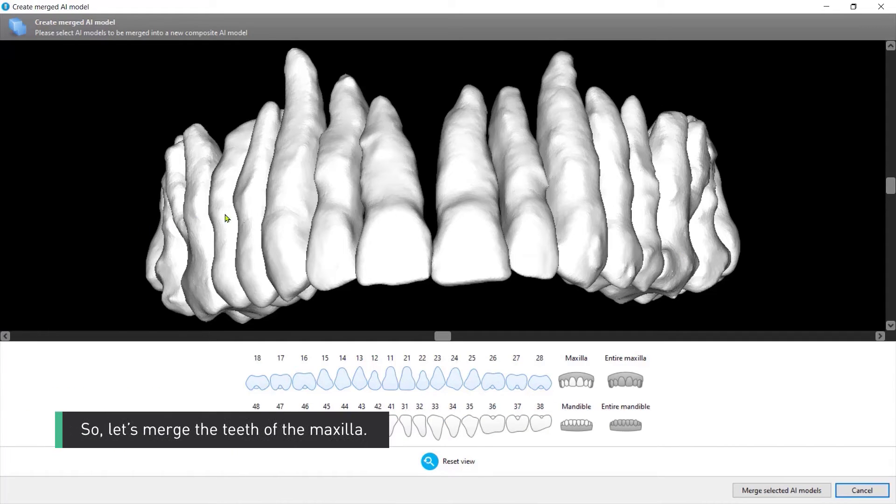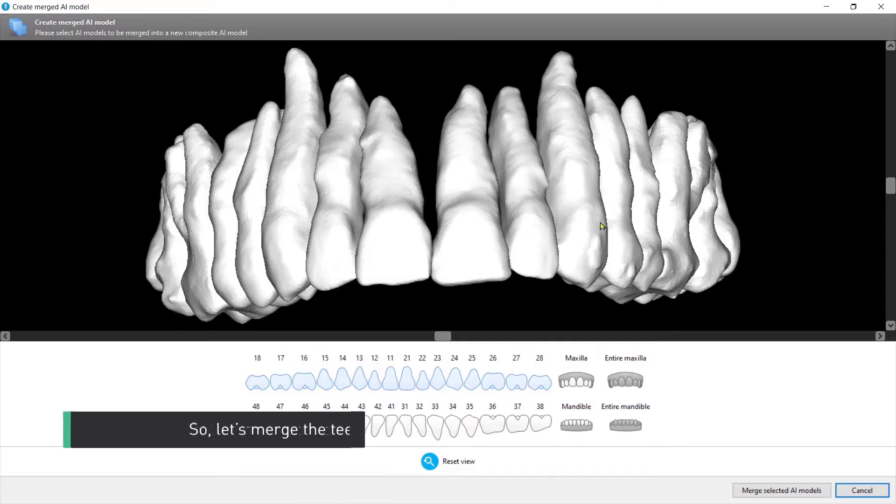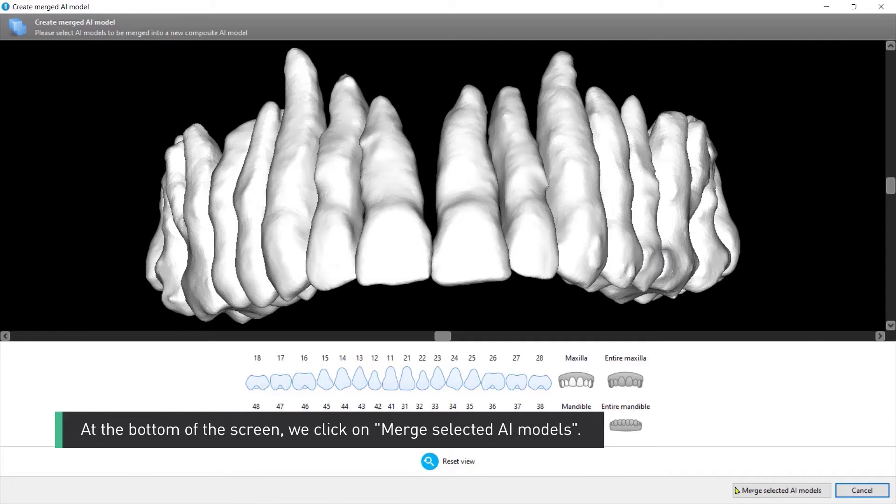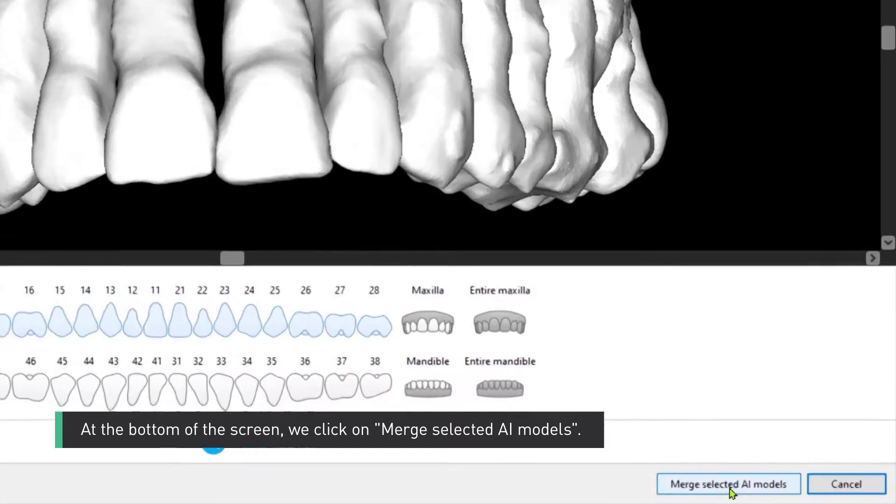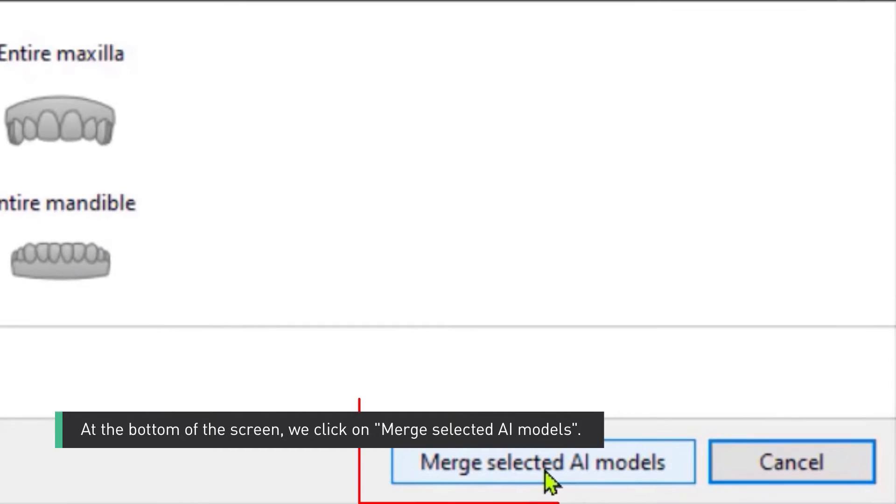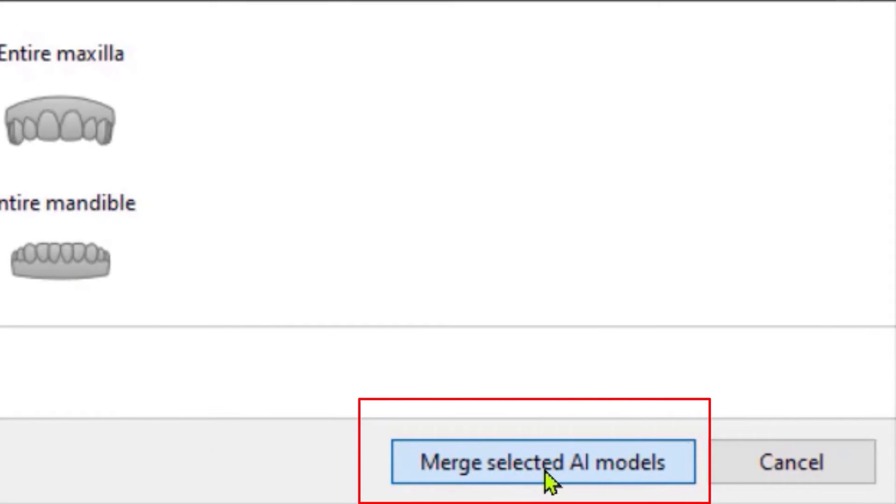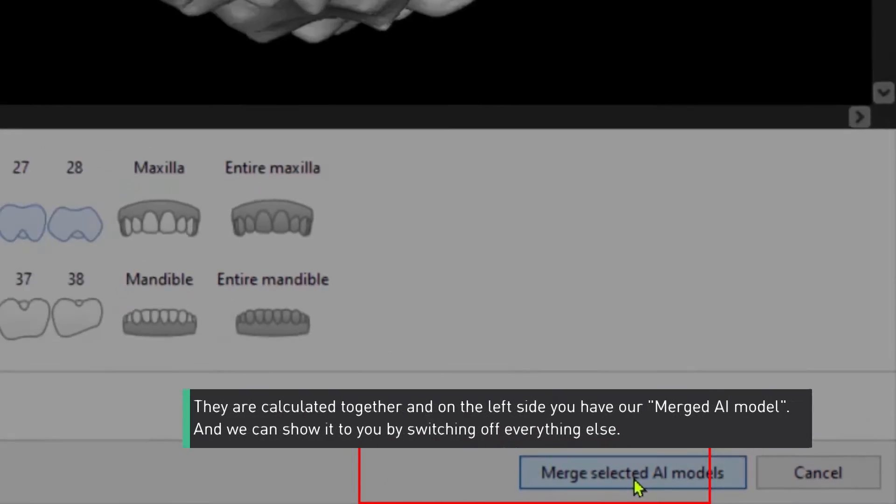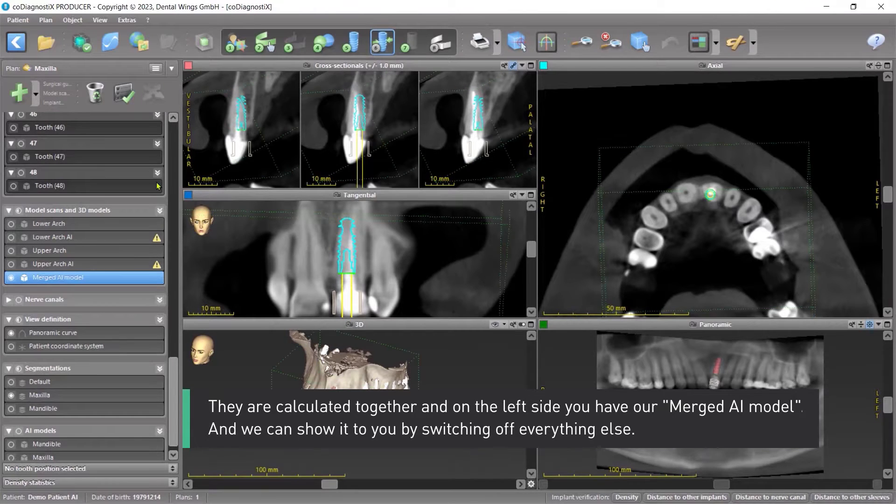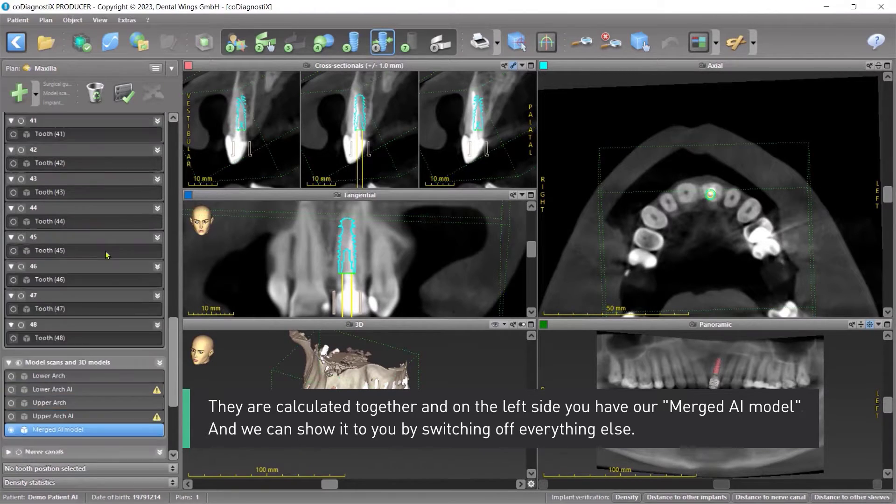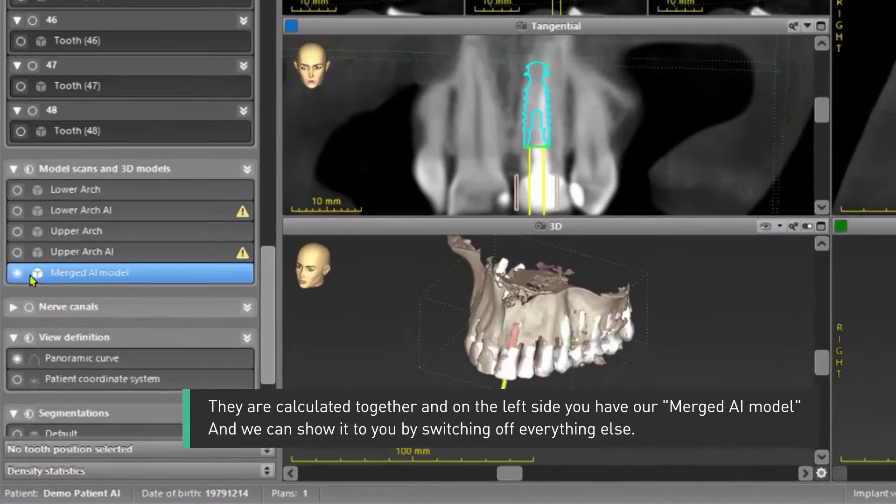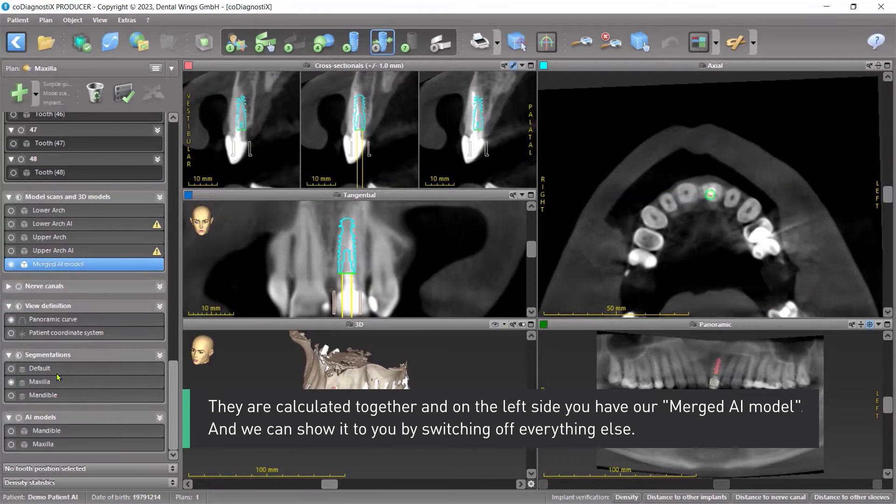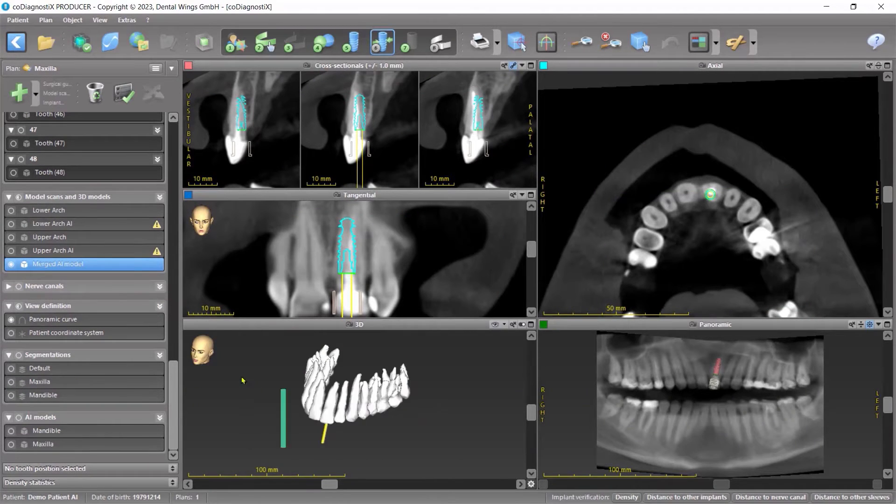So let's merge the teeth of the maxilla. At the bottom of the screen we click on Merge selected AI models. They are calculated together and on the left side you have our merged AI model and we can show it to you by switching off everything else.